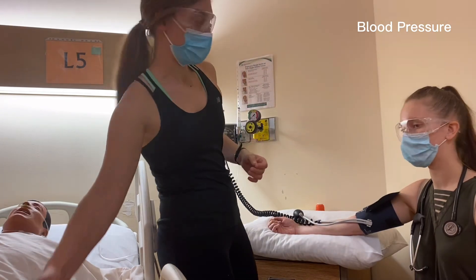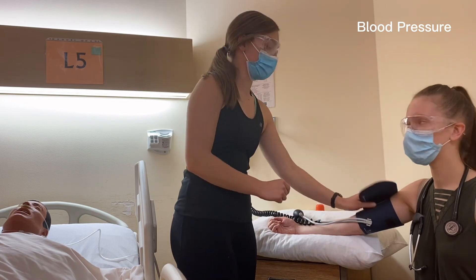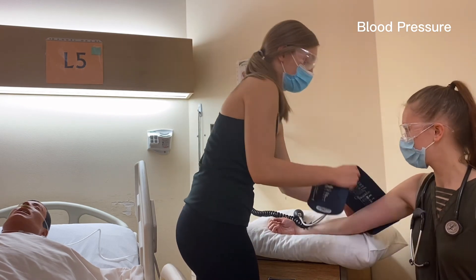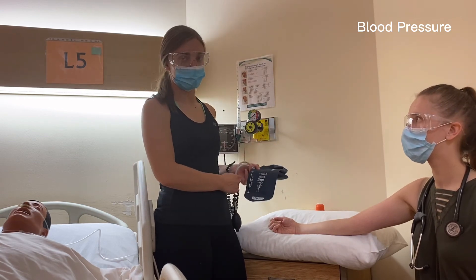We're recording the blood pressure as 102 over 78. We're also going to take note of the arm it was taken on — it was taken on the right arm — and that she was in a sitting position.